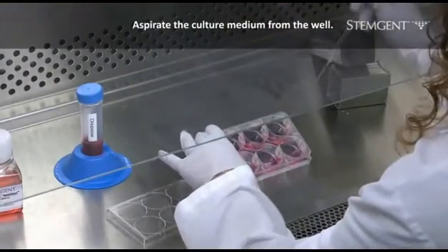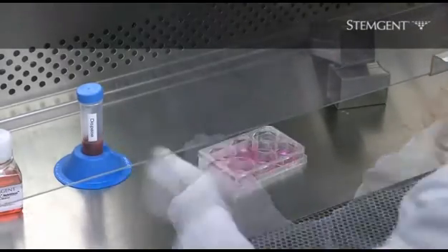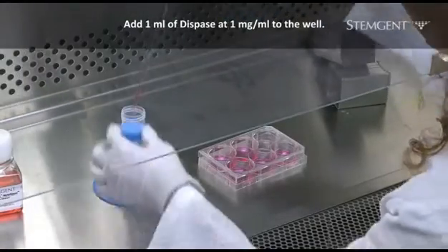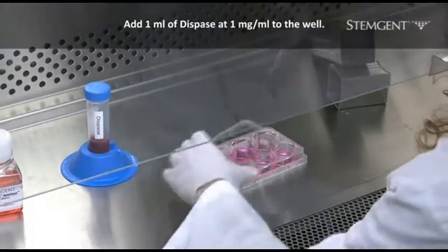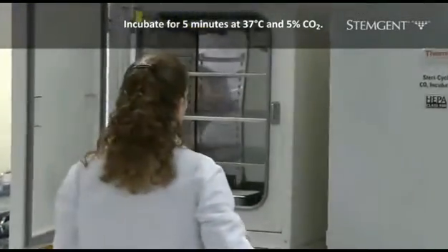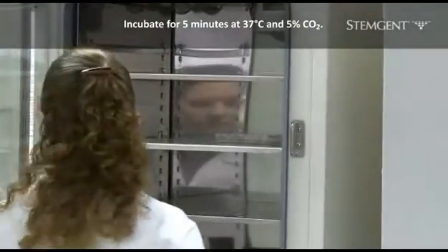To begin, aspirate the culture medium from the well of HES cells to be passaged. Next, add 1 milliliter of dispase solution at a concentration of 1 milligram per milliliter to the well. Incubate the plate for 5 minutes at 37 degrees Celsius and 5% CO2 until the edges of the colonies begin to loosen from the plate.